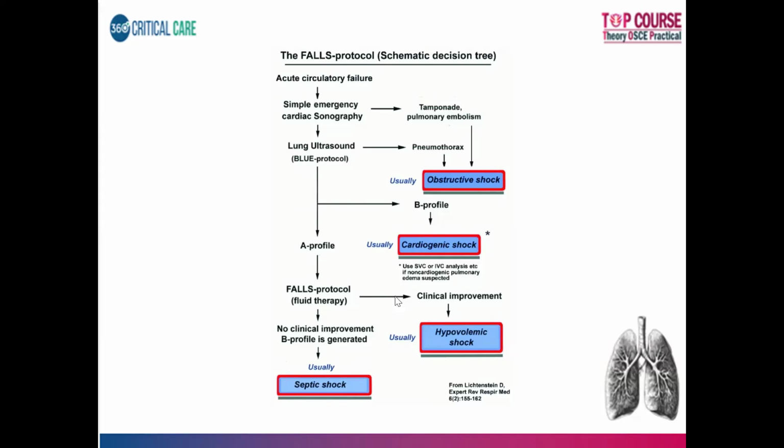But during fluid therapy, in all these processes, if the patient develops B profile, and the patient does not have any active collection anywhere based on your EFAST scan, then probably it is a distributive shock, that is your septic shock. Okay, so this is how we usually go about the FALLS protocol.